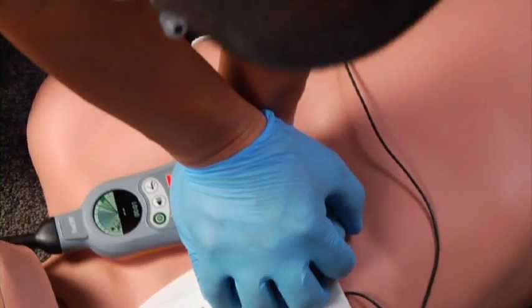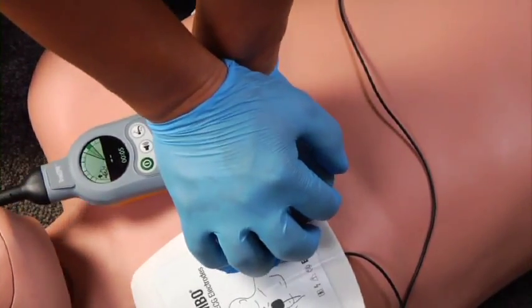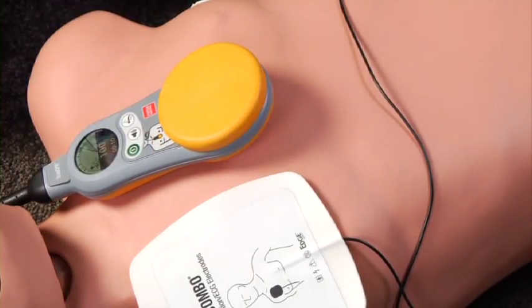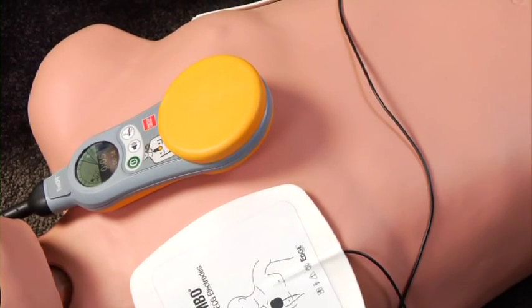During defibrillation, it is okay to leave TrueCPR powered on and applied to the patient, but make sure the TrueCPR device and cable are not in contact with the defibrillator electrodes or wires. No one should touch the patient or the TrueCPR device during defibrillation.